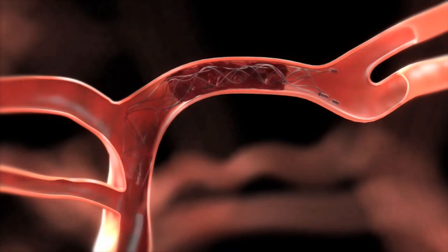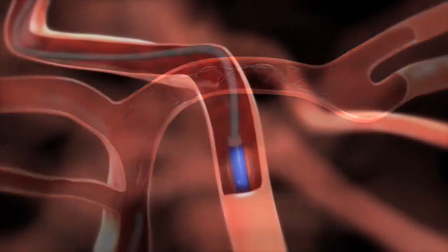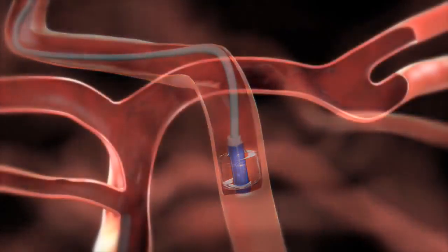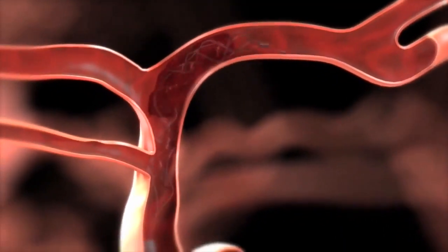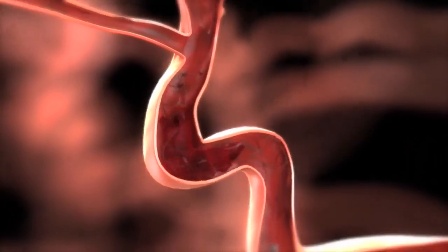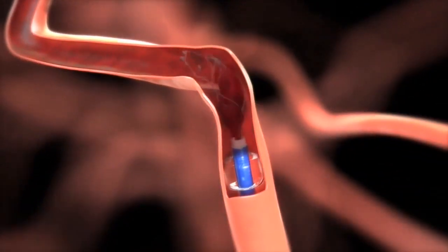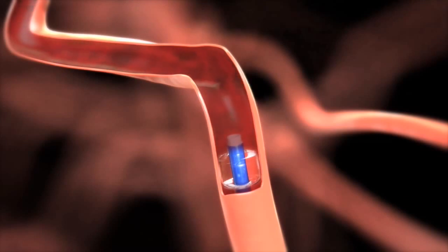After the 5 minutes is over, we inflate a balloon in the carotid artery in the neck, which arrests flow, and then we pull back the stent retriever device with the clot entangled inside it into that balloon catheter. The purpose of inflating the balloon in the carotid artery in the neck is to reverse flow from the brain arteries and into the catheter out of the patient's body.